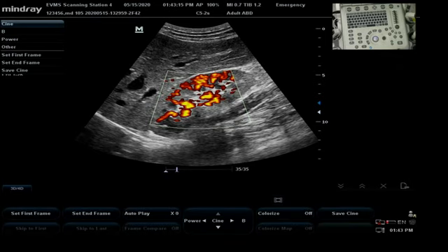Breathe. The strength with power Doppler is that it is much more sensitive, and if there's any doubt, this is an excellent tool to double check that flow goes all the way out to the very base of the renal capsule, all the way out to the edge of the cortex. What does power Doppler not do? It has no directional information, and it has no velocity information. Why? It doesn't rely on an angle, so it's easier and again more sensitive.